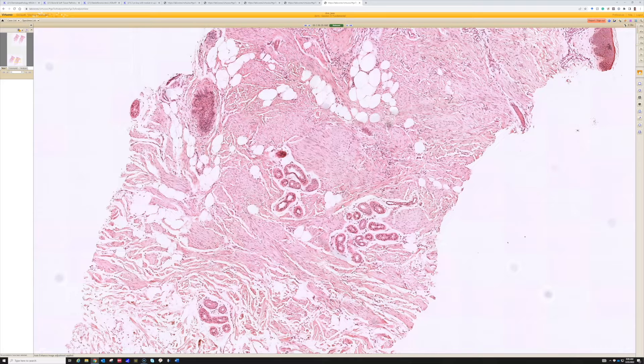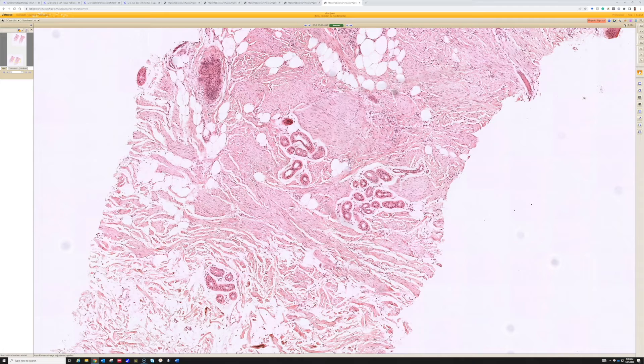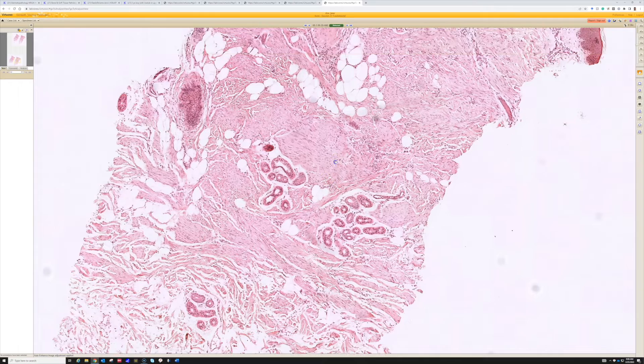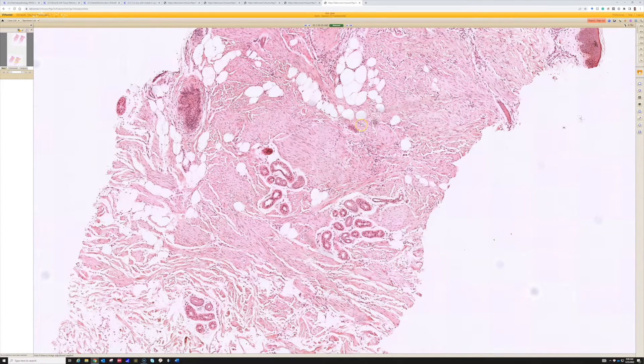And in any case, that's a topic for another video. But fibroblastic connective tissue nevus will be CD34 positive, and it often trickles down into the fat.